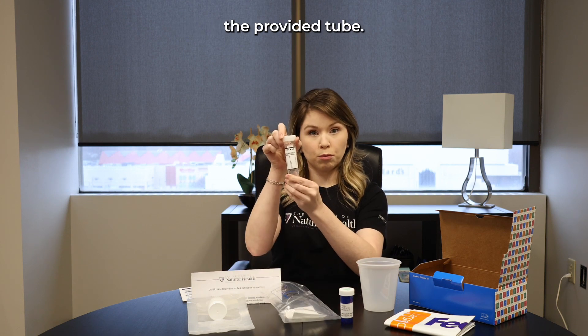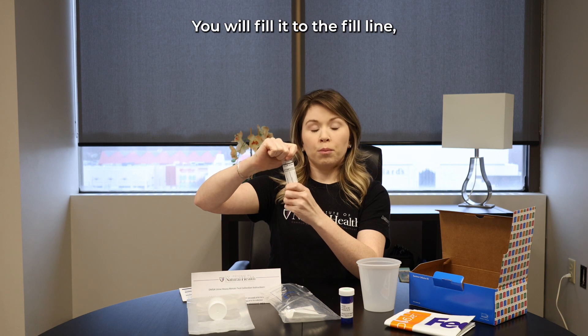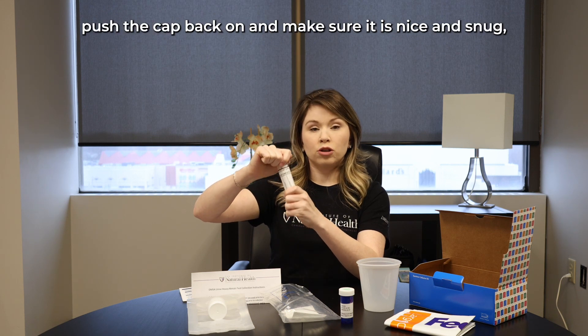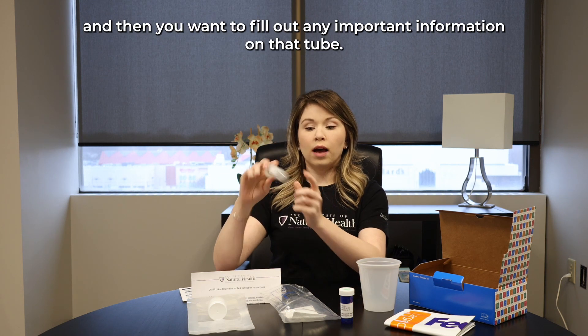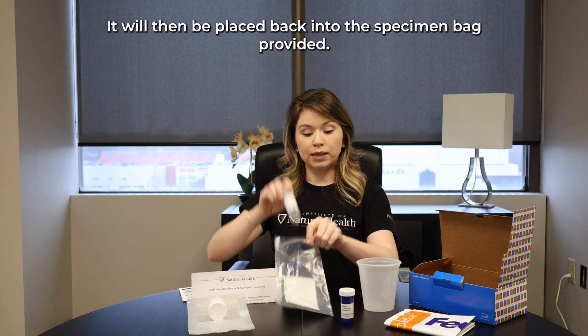Once your eight hours is complete, you want to mix up your sample really well and you will pour your sample from the master bag into the provided tube. Fill it to the fill line.